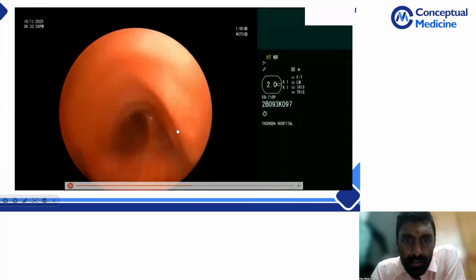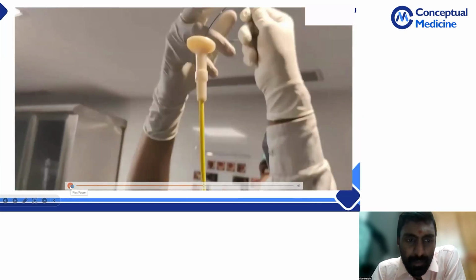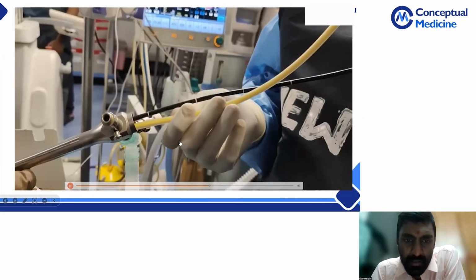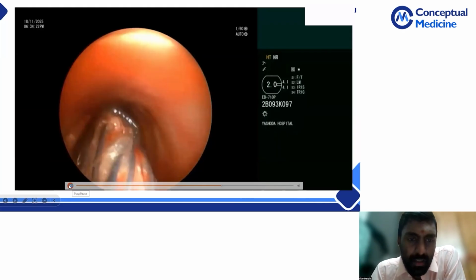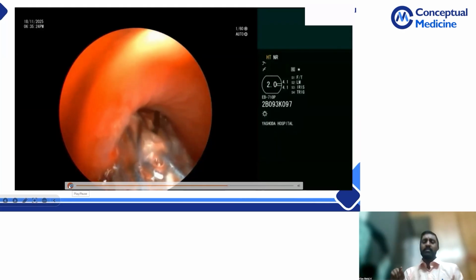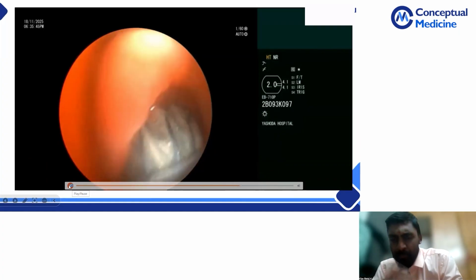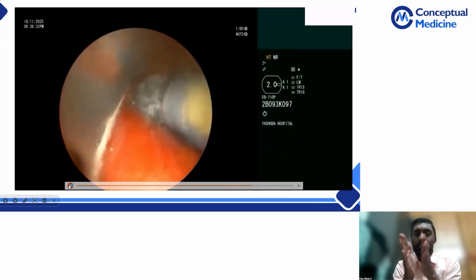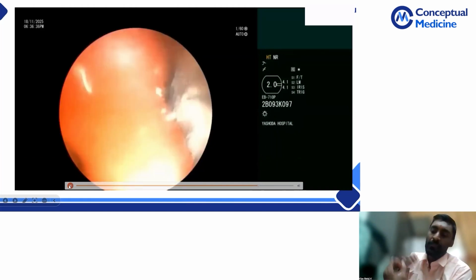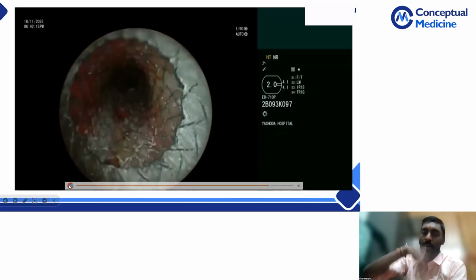Okay. You see, you have to time where it has to be placed. So this is a stent. Okay, this is a stent. You see, they are deploying a stent. With fluoro guidance, they have seen this is the point of optimal deployment, where if you deploy, you will completely close the area. So this is the trachea, this is the esophagus, let us say. This is communicating. So they go and close up the trachea with a covered stent.